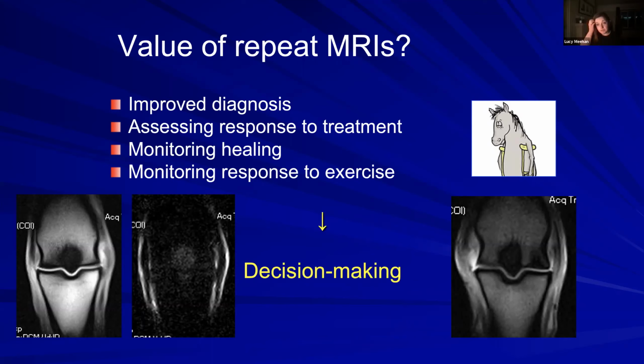Okay, it's really interesting. Those were really interesting images, especially with the degree of change that you're seeing where the horses are sound. Certainly, if you just looked at the images, you'd be like, its leg's about to fall off. Yeah. And then actually, when you get the clinical integration and realize the horses are sound and cantering every day, I think I would be panicking slightly that the horse's leg was about to fall off, but maybe less concerning if you've had the progression rather than just doing it at one time point. Yeah. I think it's fascinating, and I just think we don't know enough yet. I would agree. I think that's probably about everything question-wise from the floor.